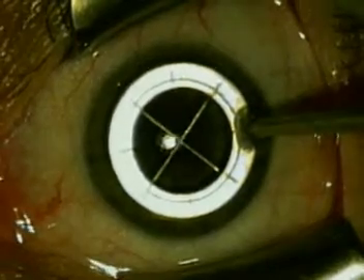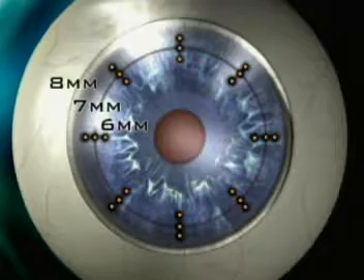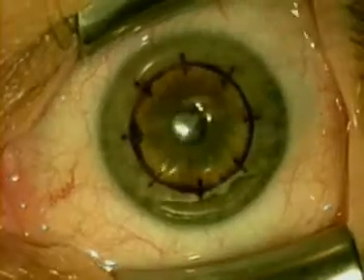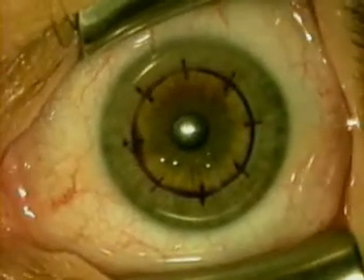The marker has hash marks at six, seven, and eight millimeter diameters. The continuous circle, centered around the center of the pupil, is at seven millimeters, so the inner tip is at six millimeters and the continuous circle is at seven millimeters.